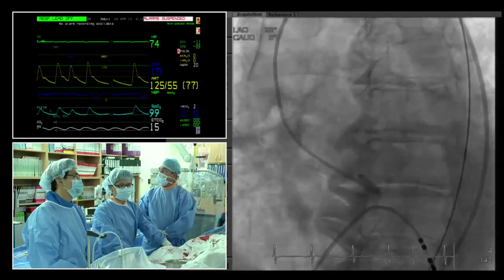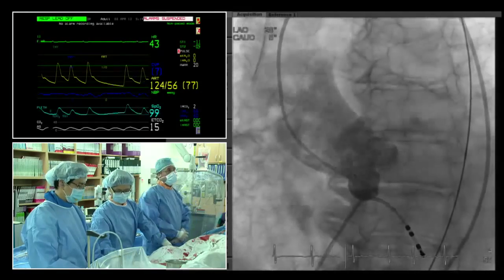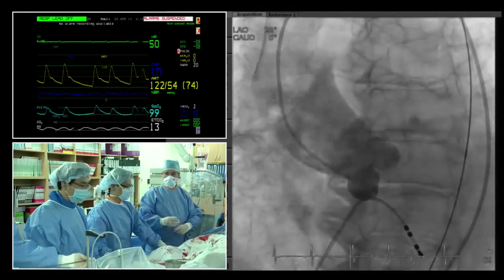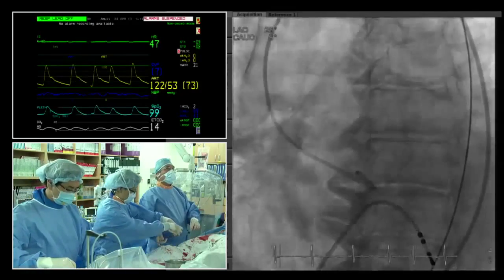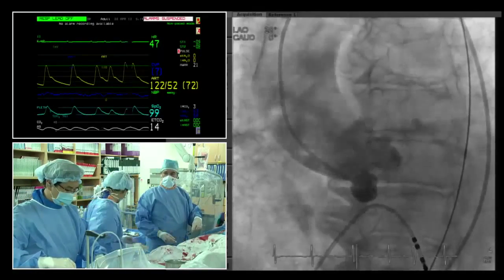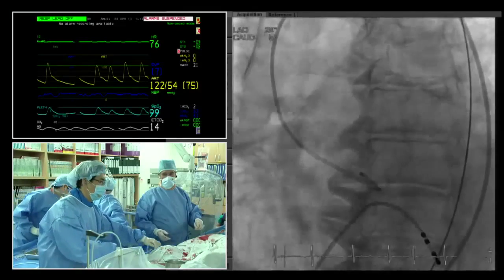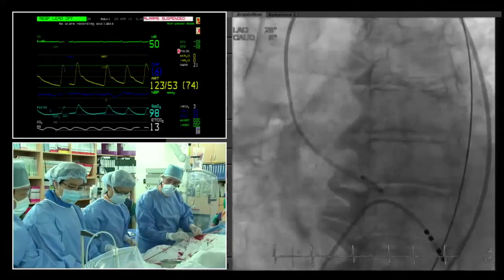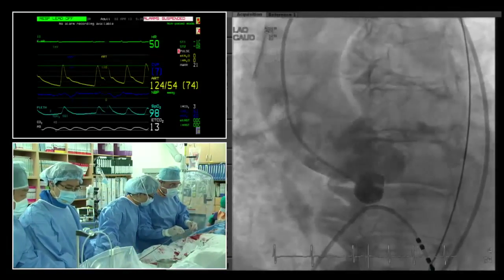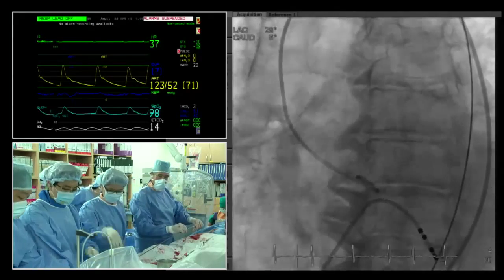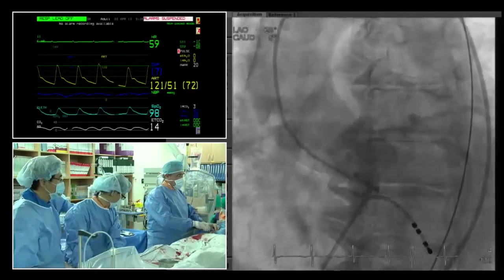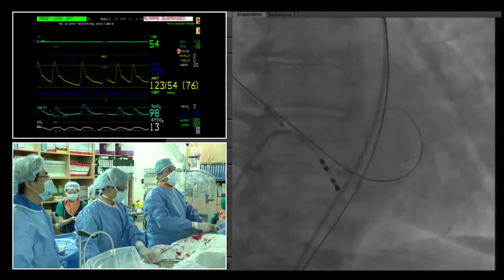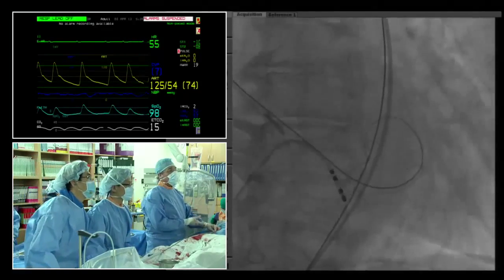Panel agrees this pacing strategy is a very important point. Everhard says he usually does not pace for CoreValve, but here with a heart rate between 45 and 60 bpm, this is actually an indication where he would also pace — just to ensure the heart rate is regular and to avoid a sudden long diastole that could kick the valve up.